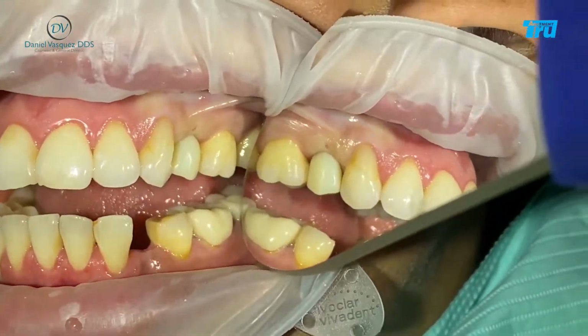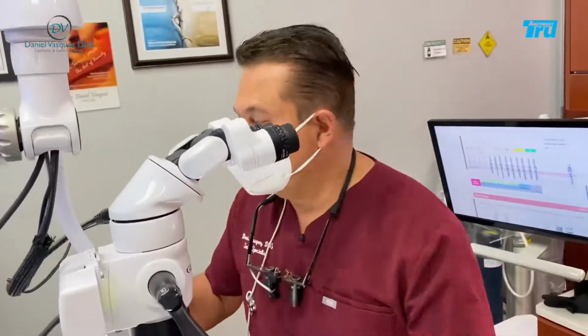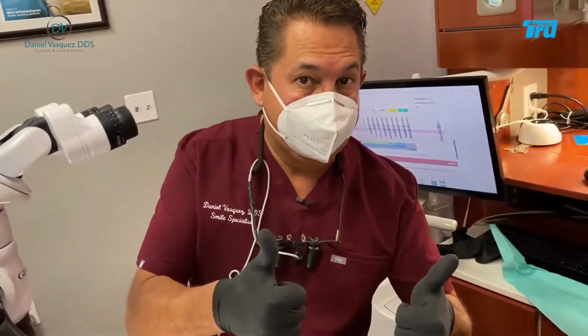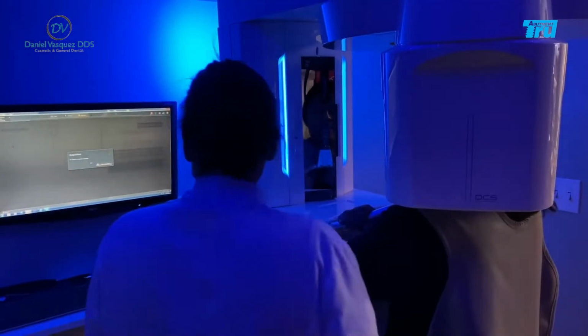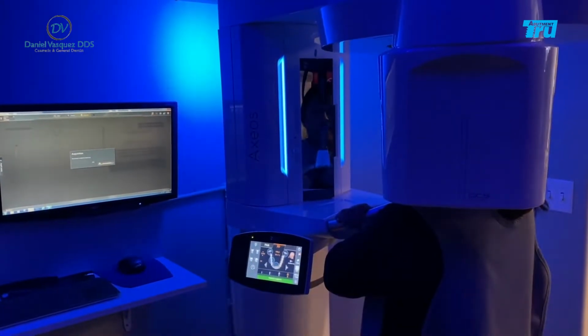Open please, and bite down there, bite down. Stay very still and don't move. This is so cool.